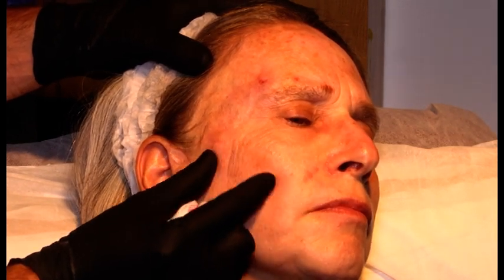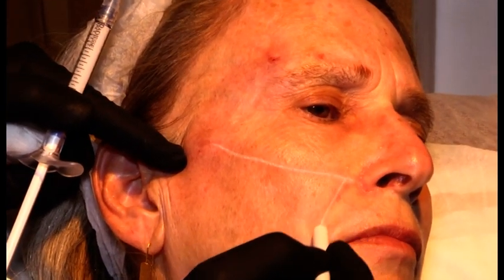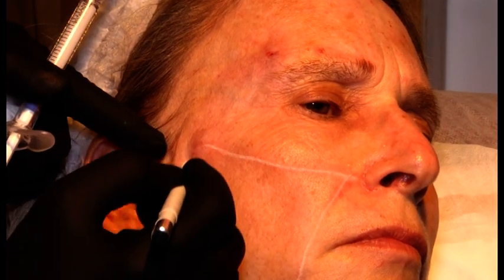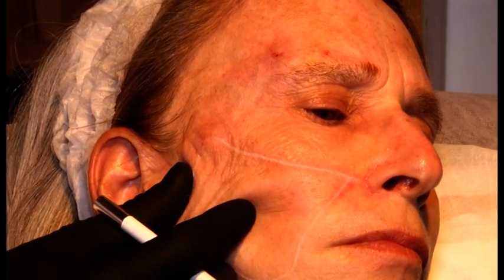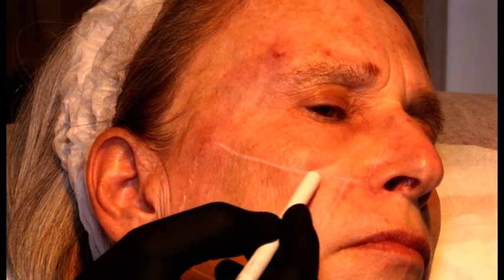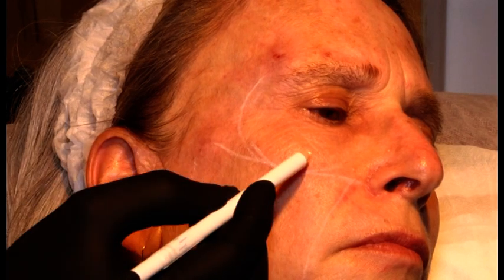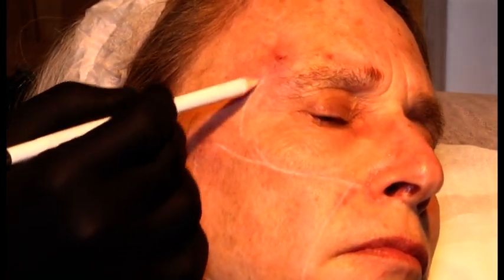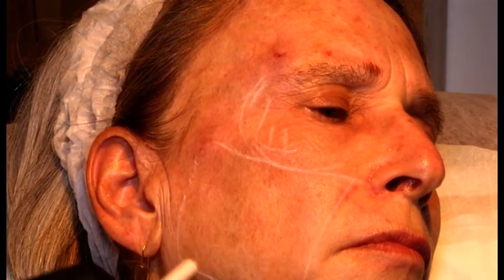So this is skin laxity. Over here you can see laxity of the skin. And what I'll do is, from here, I will mark this area like this. This whole area, I want to stimulate. Because if you look at all these fine wrinkles over here, if I get too close to the orbicularis muscle, I may cause some problems like malar edema. So normally I stay away from this very thin skin. This is where I'll be injecting Belotero Revive. So this is the Revive area, and this is the Radiesse 1-to-1 dilution area.